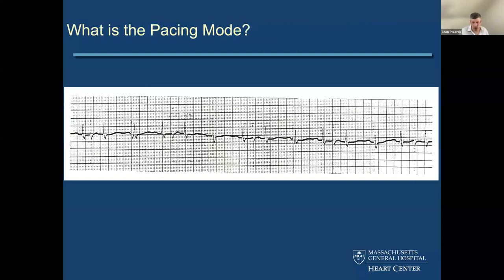How about here? Well, very similar situation where you have pacing going across the tracing. Once again, the pacing is not as obvious to see because this is an old photocopy from many years ago, but you see that there's a pacing spike happening across the tracing at about 60 beats per minute going all the way across. The pacing interval never changes when you go across. Occasionally, you see evidence of a pacing spike followed by what appears to be a P wave and then a PR interval that's fairly constant after that.